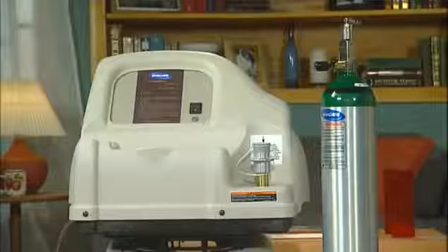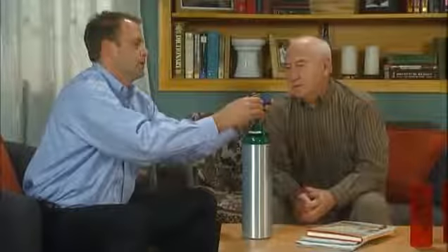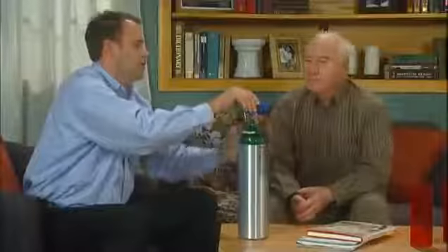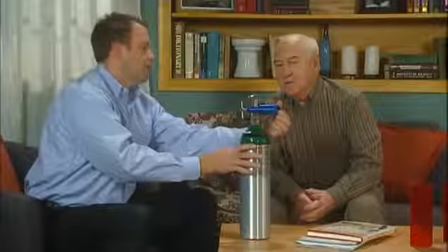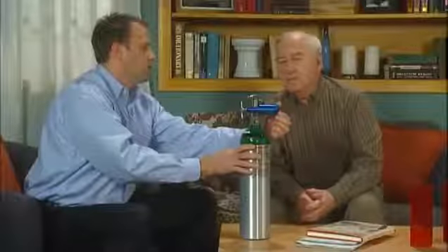Your provider will explain how to use the style you have. The post-valve cylinder allows for the use of a compatible regulator or conserver. Your provider will instruct you in the use of your regulator or conserver. It must be in the off position when not in use. When installing any regulator or conserver on a post-valve cylinder, consult the owner's manual for proper installation and removal instructions. Do not open the cylinder until the regulator or conserver is installed.